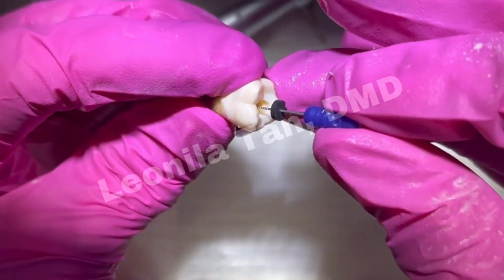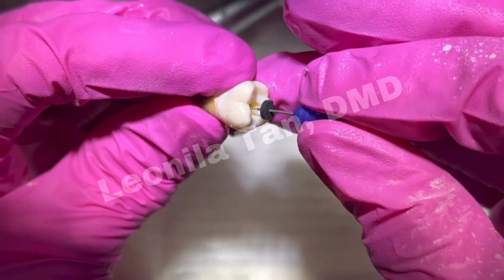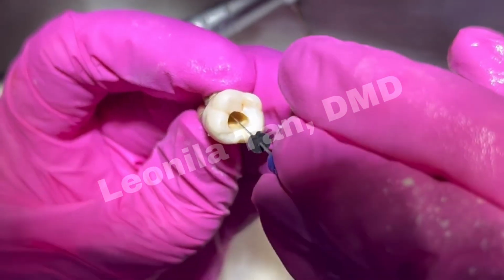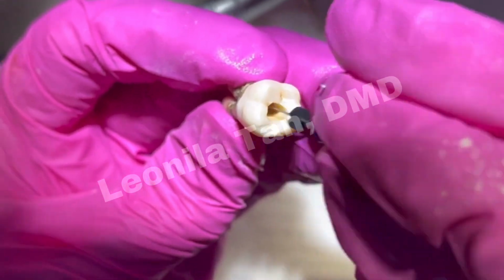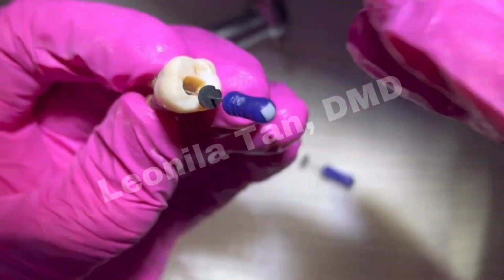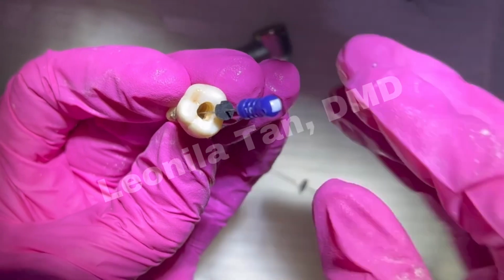This one goes more straighter. Okay, that's going to your mesial buccal. Then notice your distal goes in also easier, but still it goes on an angle, so you still need to open up or diverge the walls.